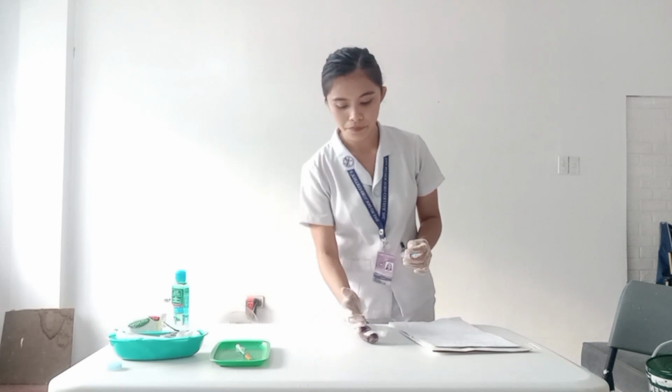So I will now proceed in injecting the medication using the Z-track technique. Using the ulnar side of my non-dominant hand, I have to pull the skin approximately 2.5 centimeters to the side. So, under some circumstances, such as for an emaciated client or an infant, the muscle may be pinched. So now, hold the syringe between the thumb and forefinger as if holding a pen or a dart. And then I have to pierce the skin quickly and smoothly at a 90 degrees angle. So this is done to lessen the client's discomfort.